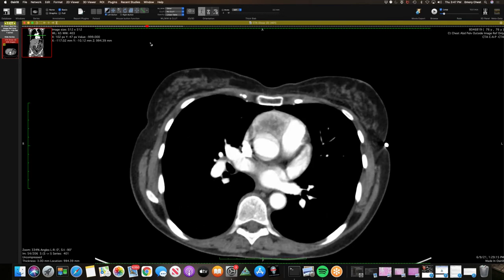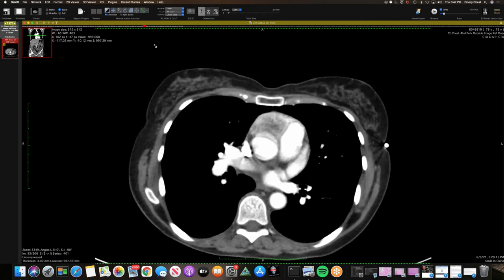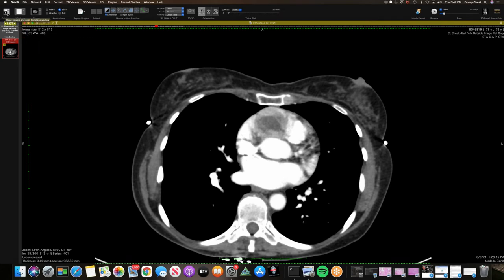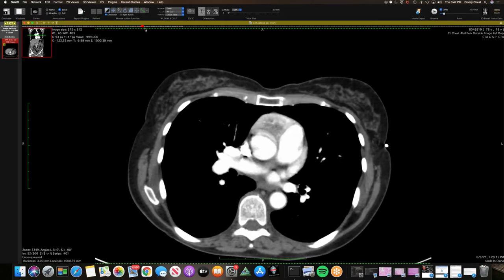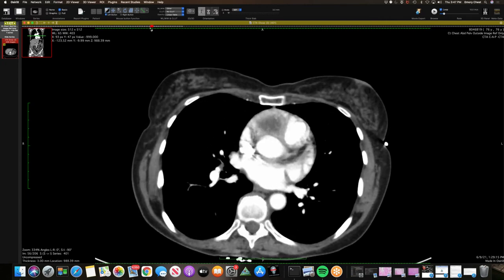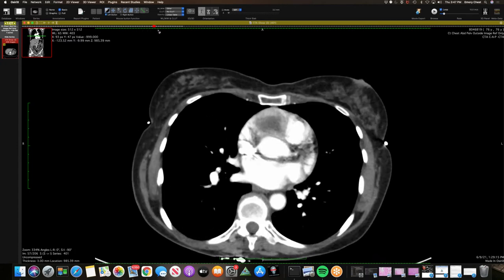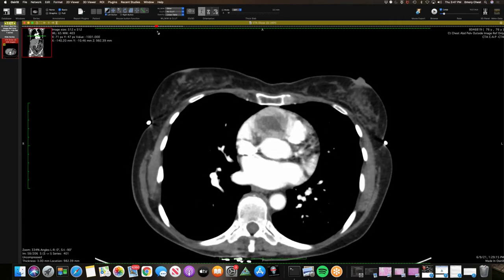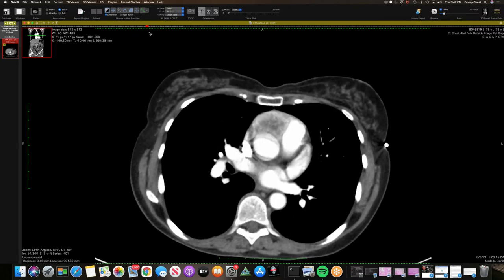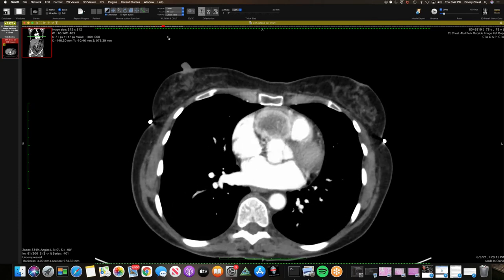Yeah. It's good. Great location. We've seen a few of them recently, kind of large paragangliomas in either the subcarinal region or mediastinum. But yeah. Is that intrapericardial? That was a good question. I told the surgeon I wasn't sure, and he said it doesn't really matter. He'll take it out anyway. I couldn't make up my mind, but it seems like it's right there. Yeah, it seems like it's got to be, because you see that little claw extending to the root of the MPA and the aorta. These almost always arise from the cells adjacent to the coronary arteries, from my reading, and then they parasitize the coronary arteries. So I think it would have to be intrapericardial. Yeah.